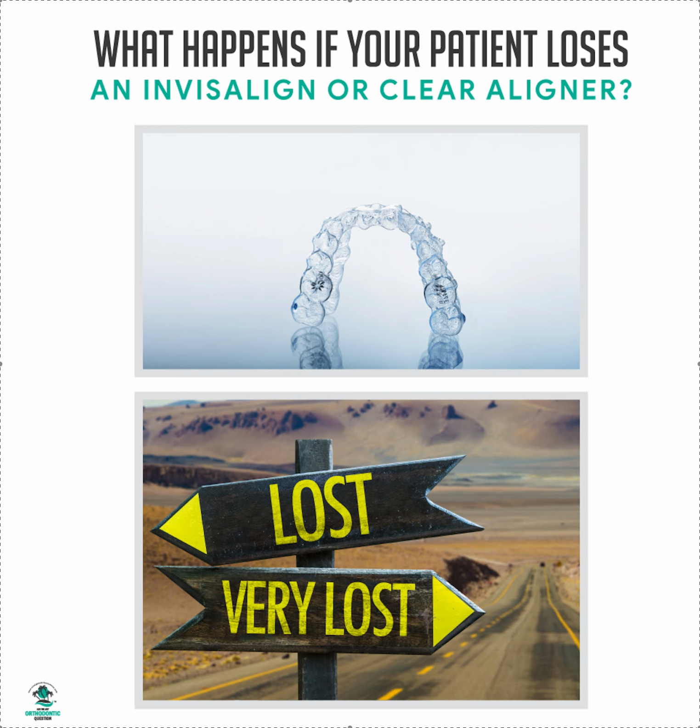So let's open a new packet. Let's try aligner 21, upper and lower. Patient's in the office, was going to get new aligners anyways. See if that seats. Which one seats better? The one before or the one after? Find which one seats better. Then stay in that aligner for 2 weeks using Chewies and get it to settle. If you end up picking aligner 21, you're home free because you already have the rest of those trays. The old ones don't matter.